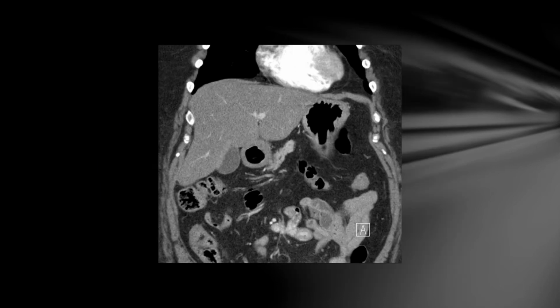Another advantage of functional imaging is identifying multifocal disease, as Chris outlined. It's not an uncommon occurrence. Up to 30% of small intestinal neuroendocrine tumours are multifocal. And also a subset of neuroendocrine tumours occur in the setting of a genetic syndrome like MEN, which can predispose to multiple tumours. This patient had a mesenteric mass and a small intestinal tumour, which looked typical for a neuroendocrine tumour.